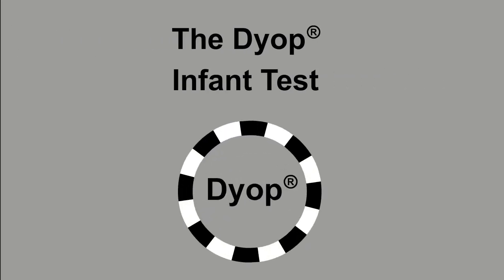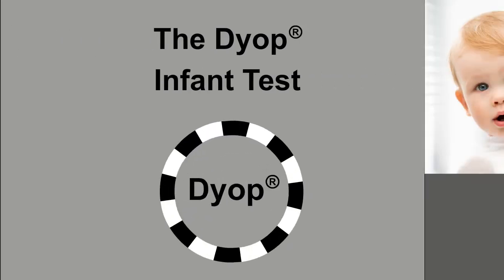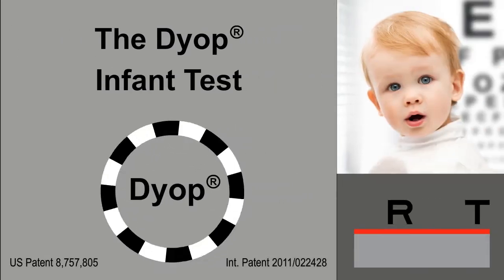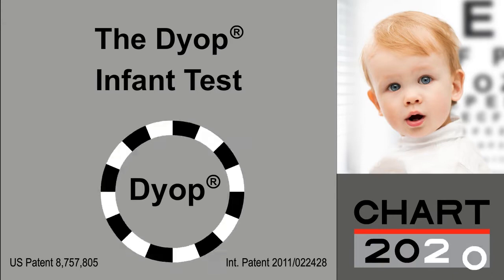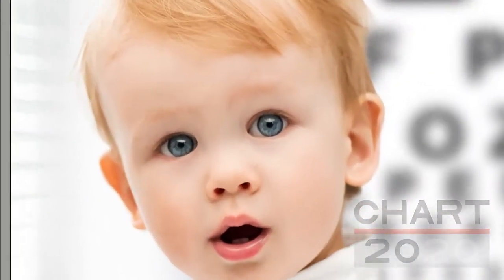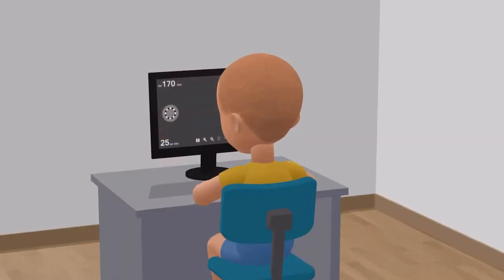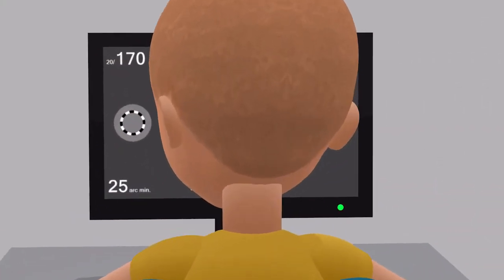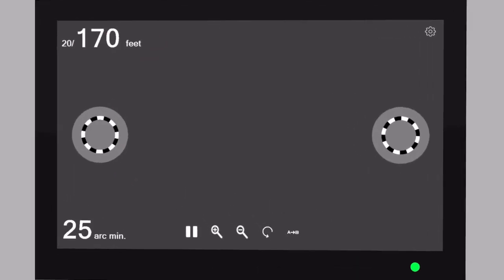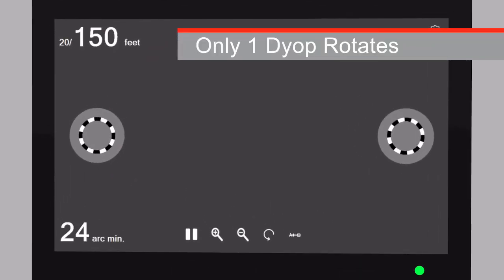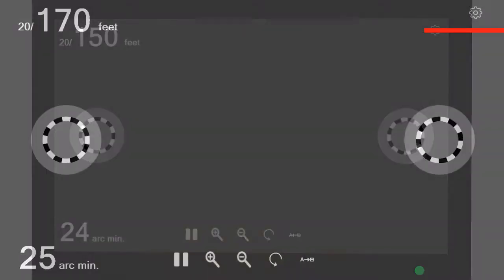The DIOP infant test is a rapid and simple way to measure visual acuity of an infant, child, or nonverbal adult. Identical size DIOPs are displayed on opposite sides of the monitor, but only one of them is rotating.